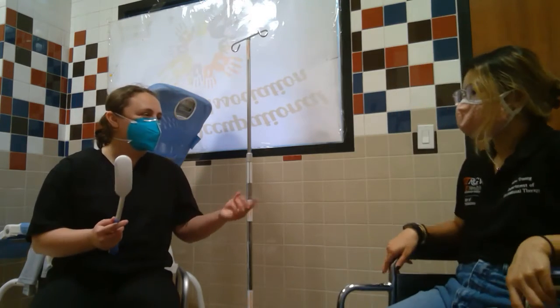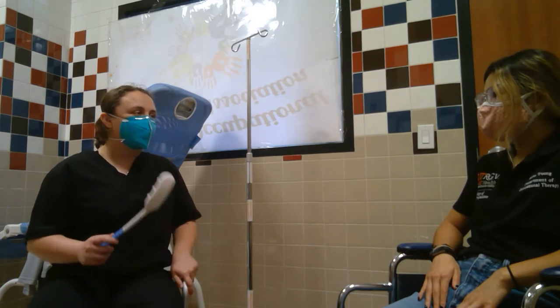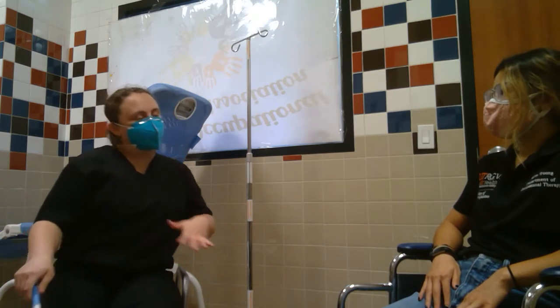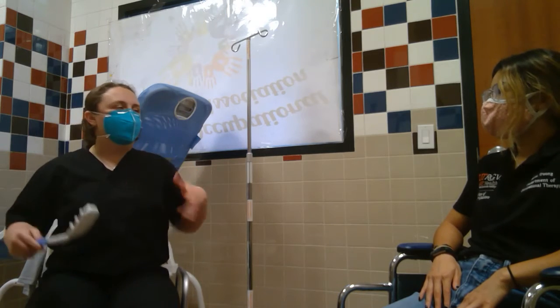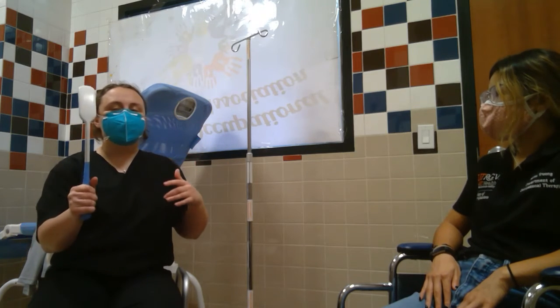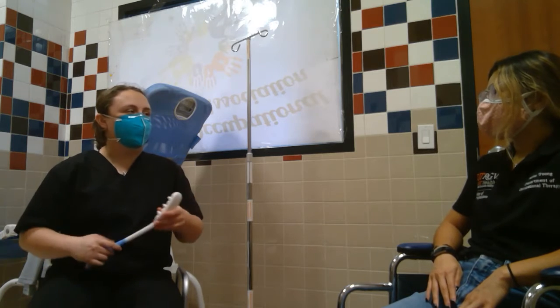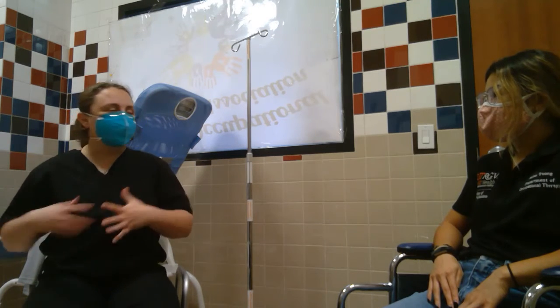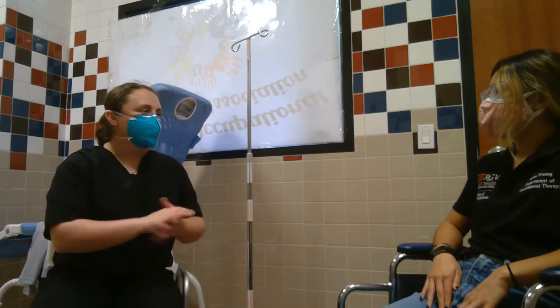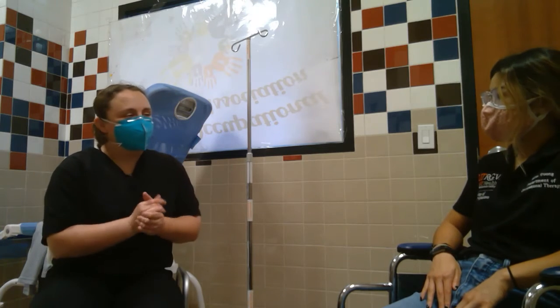The other thing, maybe you've seen it, this is a handheld shower head. Some showers just have them for fun, but it's because you may be sitting for a little bit while you shower. It's just going to make it easier to really wash yourself so that you don't have to move around too much, or maybe you don't get all the soap from a normal shower head. This is going to allow you to really wash yourself all the way around and make it a lot easier. The last thing, which we'll show a little bit later, is a tub bench that you're going to be sitting in, and it's going to help you get into a tub to be able to bathe yourself.